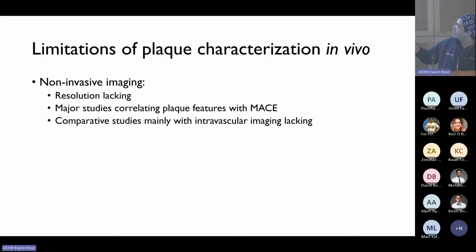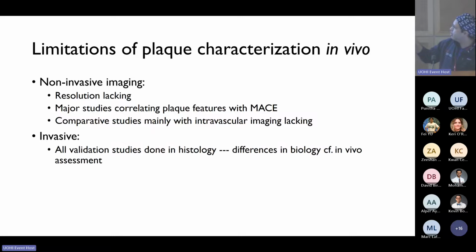And comparative studies that have been done with CT tend to be done against intravascular imaging, because as you can imagine, doing a histology study with CT is quite tricky. There are a couple. There's a company named Elucid that's trying to validate an automated plaque characterization tool with CT, and they've done it with animal studies and histology. And they've got their algorithm and tool out now for sale, actually. And it's already being sold to CT departments around the world to help pick up necrotic core. And they have some interesting work on histology, but it's still a watch this space moment right now.